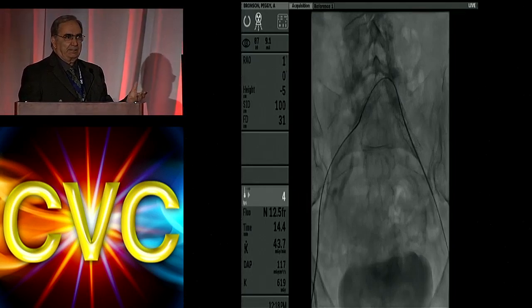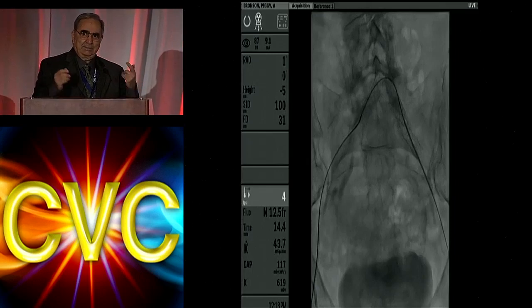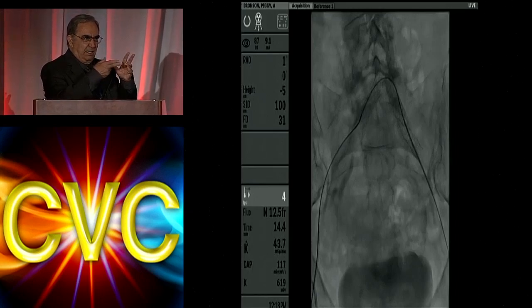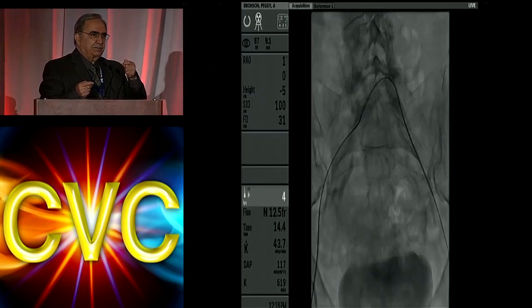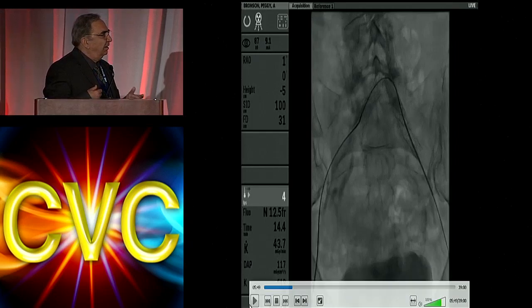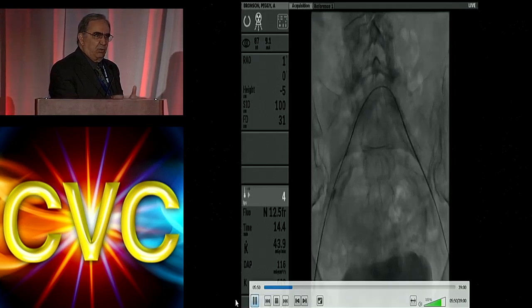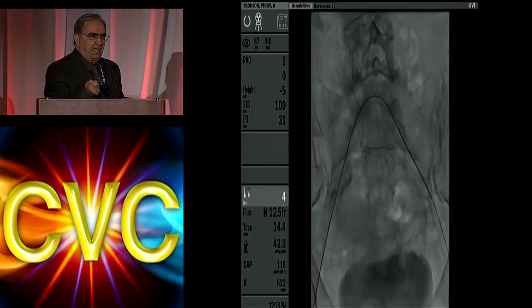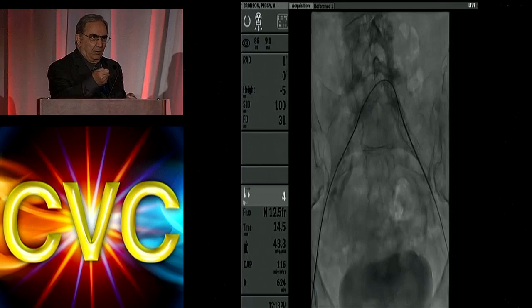So this is what I did. I cut the hub of the catheter, the end of the catheter. Then we have the Viper wire on the table. Let's go ahead and get that sheath out and get the filter, so now we're all ready with that. Then I put a 25 cm sheath over the catheter, the big one, and push it down the wire.